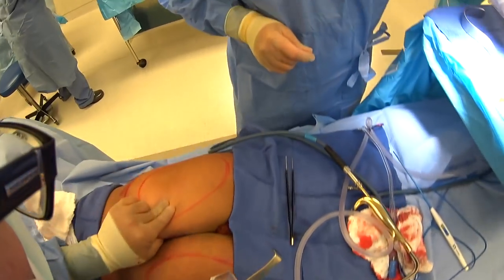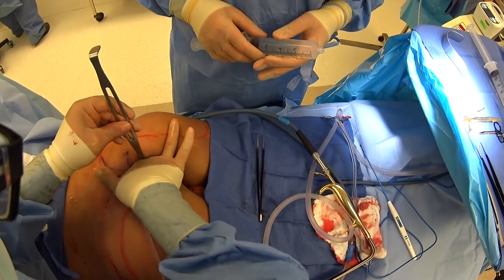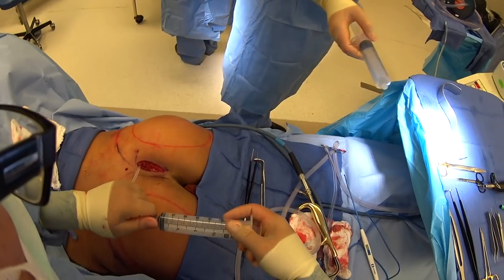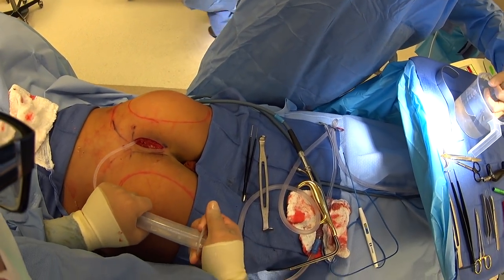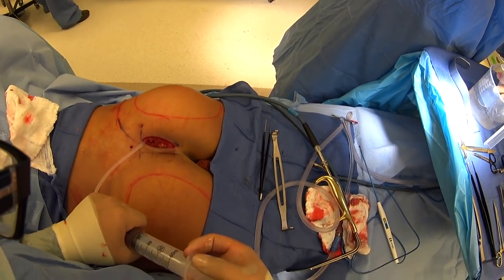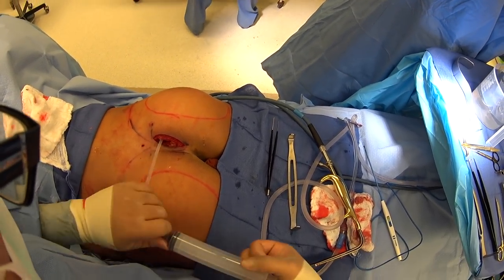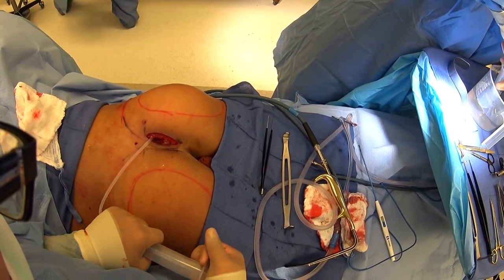Now we've created our pocket here all the way around where we've marked out. I'll just put this sizer in. The nice thing about this is we can check our pocket. We've already decided we're doing a 548cc implant, but we want to make sure the pocket's just perfect so that we don't have to take the implant in and out. We fill to 300, 360, 420, 480, 548.